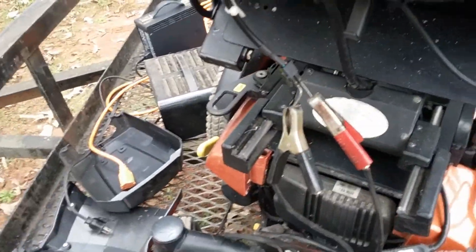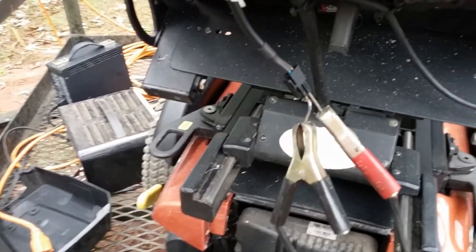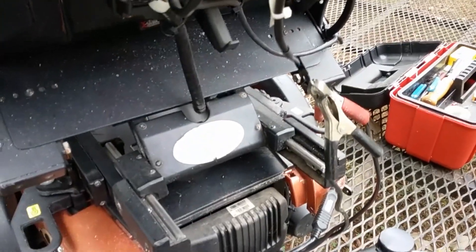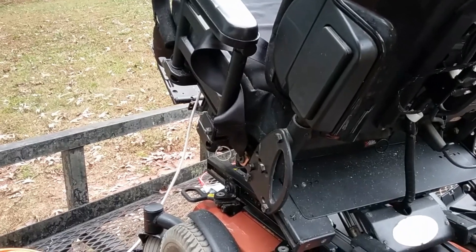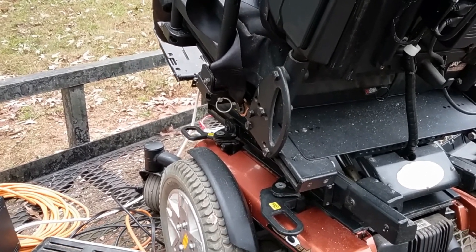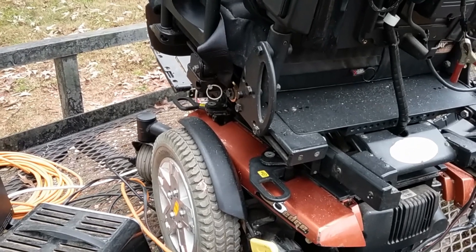I'm in the process of putting it back together. I've already slid the batteries inside — they're up in that hole. Now I need to let the chair back down. I put two jumpers in using the nails, so all I've got to do is take my power source — I'm using a power supply — and touch it to lower the chair. When I touch this, the chair should start going down. The chair is going down. I'm just going to let it go all the way back to the normal position, then hook up the regular charger. I've got the regular charger hooked up right now and it is taking a charge.